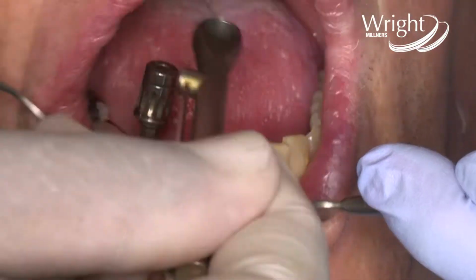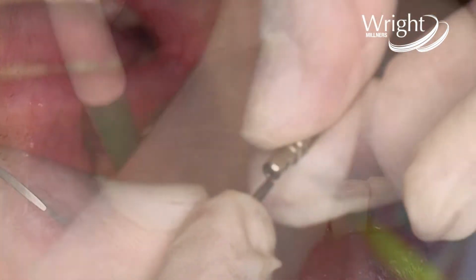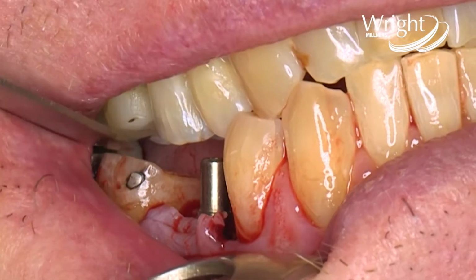Now we take an x-ray. So there's the crest of the bone. The implant is 2 mils below. There is the mental foramen, and we've got at least a 3 millimeter safety zone. These are called pathfinders. Screw them in. I can see my distances from the teeth, so we can see we've got enough for primary prosthetic space. We still have 3 millimeters.